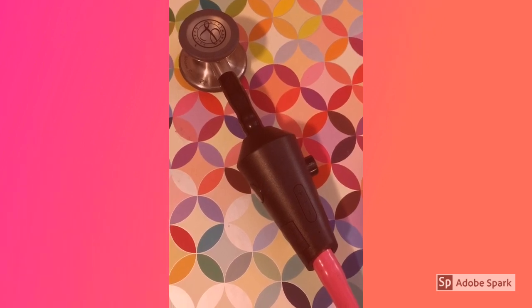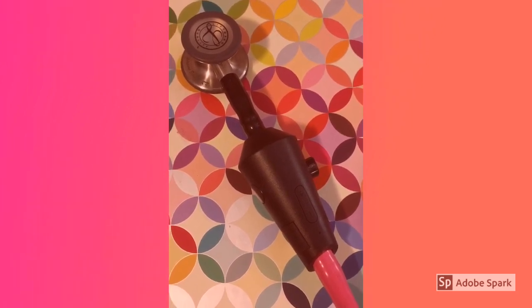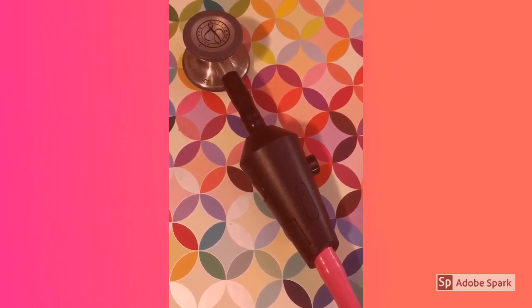Overall, I love the Echo Core attachment. I think it's worth every penny of the current $200 price tag. This can go on any single lumen stethoscope, and honestly, if you are having a hard time hearing anything, this will take that problem away.